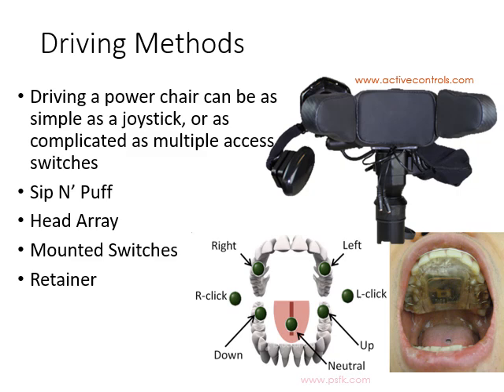to drive the wheelchair. A person can use different switches on a head array. By tilting and changing the position of their head and neck, that can activate different switches on the back of the head that command the steering mechanism as well.